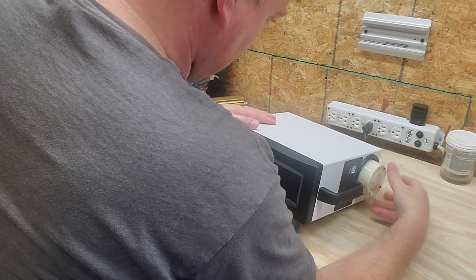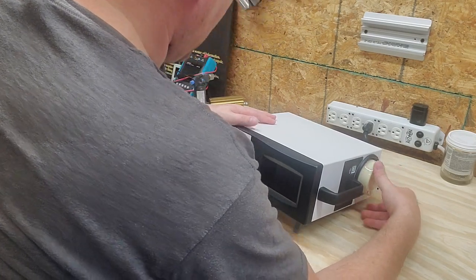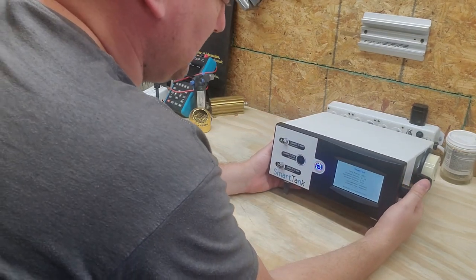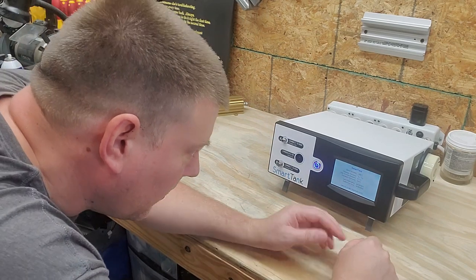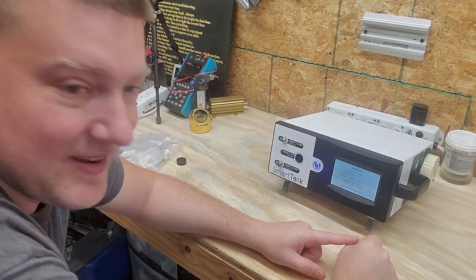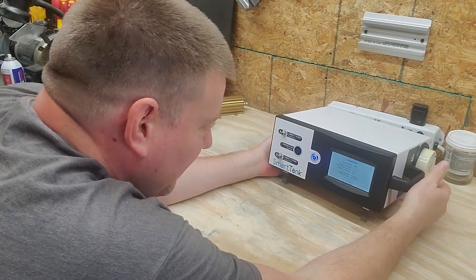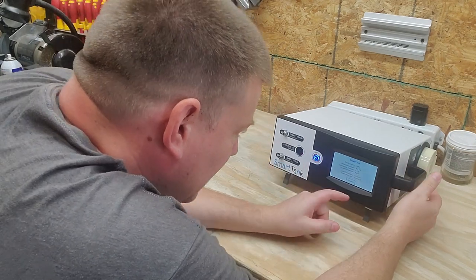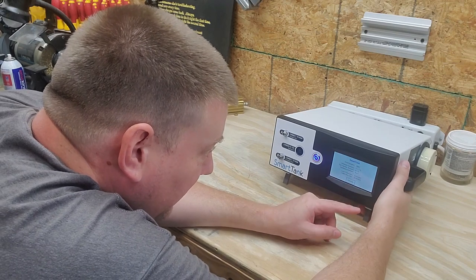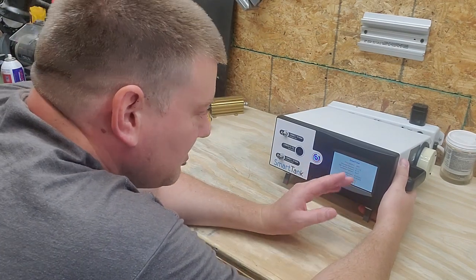Gas just goes in and screws down. This is serial number seven — serial number seven, guys. This is so cool; I'm going to be one of the first people to have one of these devices. Calibration date 9-20-21, calibration due 9-20-22. I love the fact that there's a splash screen that tells you your calibration dates. That is amazing.